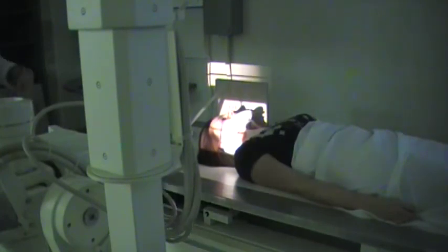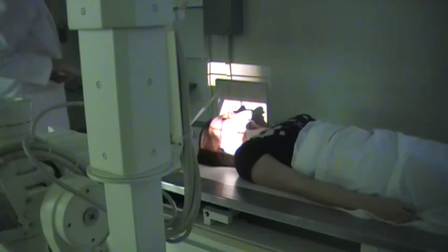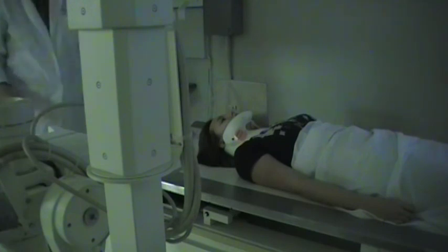Okay, so this is how we would be getting our cross-table lateral facial bone. Keep in mind we don't have to prop up the back of her occipital area, just for the fact that we're not doing the entire skull. We're just getting the facial bones. If you did prop it up a little bit, that would get it centered to the grid better, but depending on your grid, it isn't always necessary. Okay, that's all we have for the trauma patient facial bones.